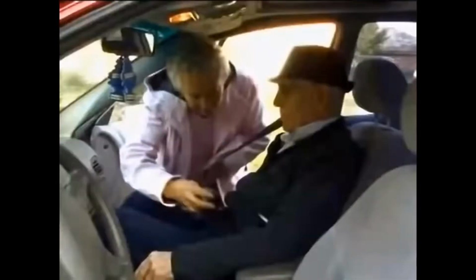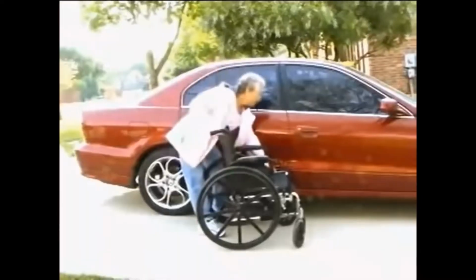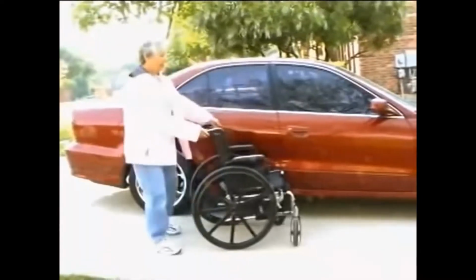To complete the transfer, help the person turn and assist in lifting their legs into the car. Finally, apply the seatbelt and close the door. Getting out of the car is the reverse process. You should position and angle the wheelchair as close to the car as possible.